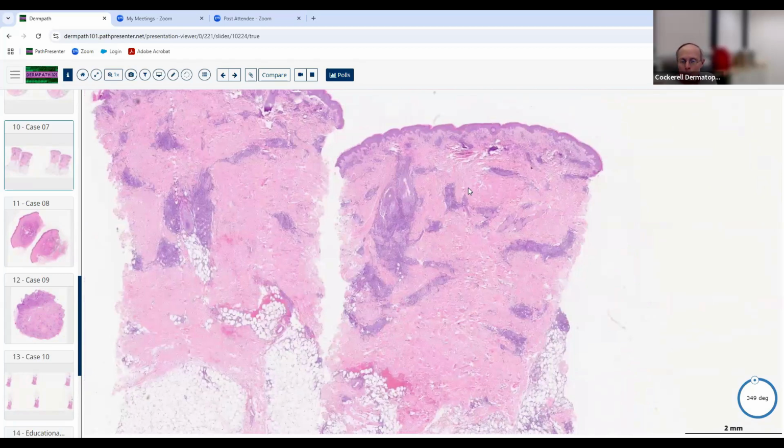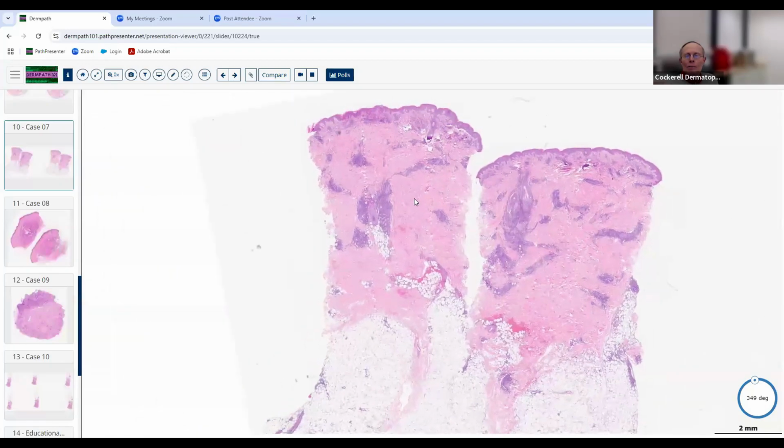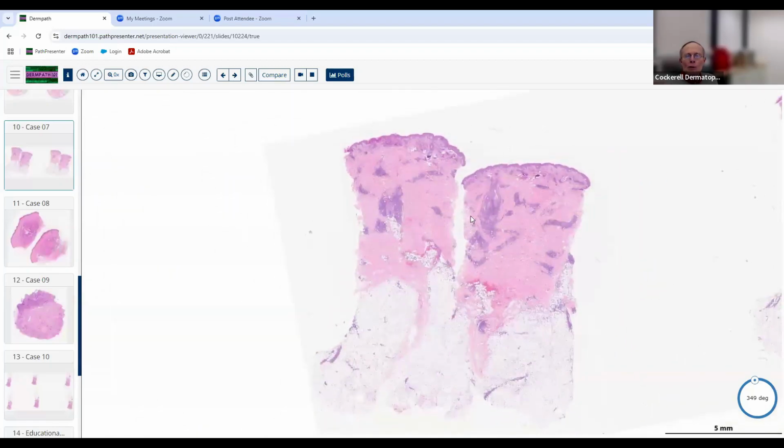And then when you look down at your multiple choice selections, you say, they've got the tumid form of lupus in here and there's mucin, so boom, that's the right diagnosis. That's the way to do this. That's how you go through an inflammatory skin disease like this. A beautiful example, a very nice biopsy. They didn't crush this. They took a gorgeous biopsy. Those are the kind of biopsies you want to take.